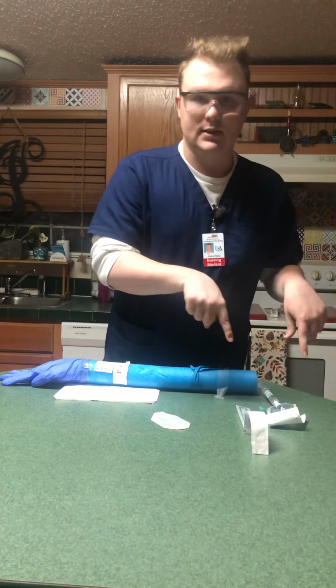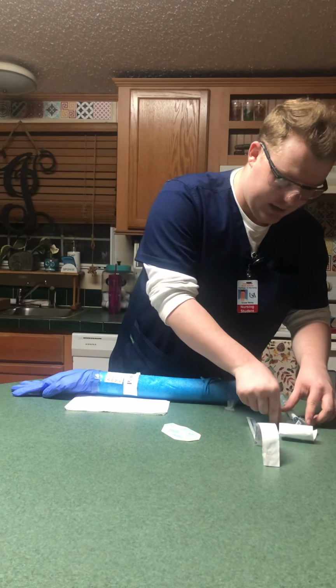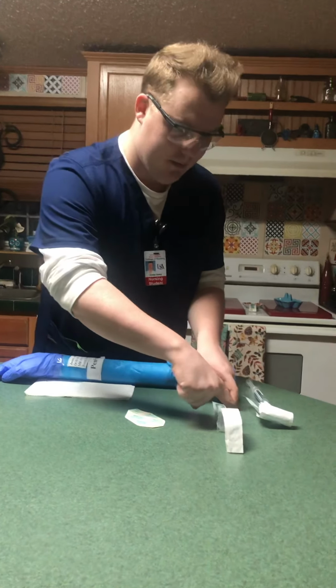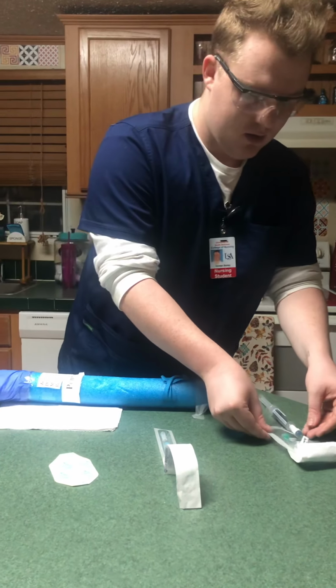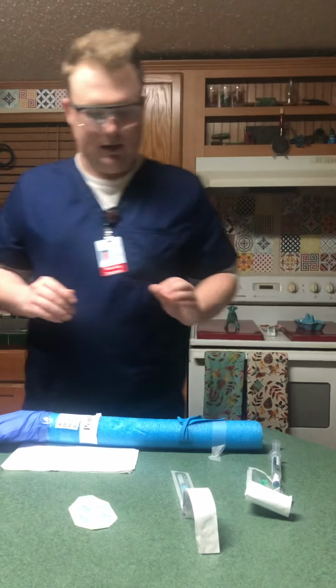And this is my break in sterility. I got one break in sterility. My cap fell out of the packaging. Normally I would not let that happen. So that was my one break in sterility. But I'm moving everything to the side. Okay, just like that. So everything's ready.